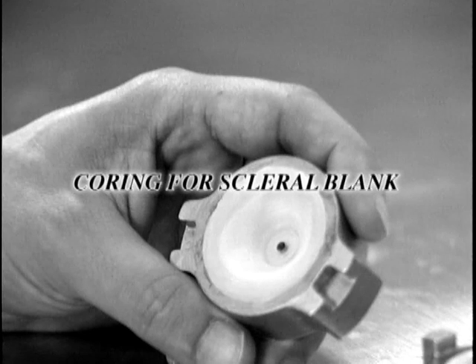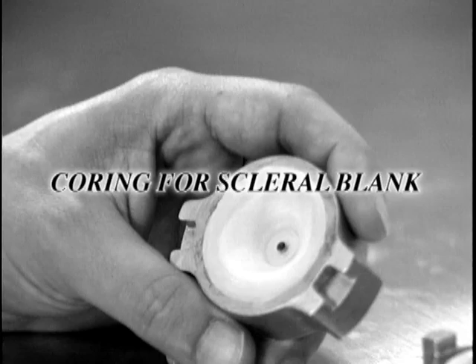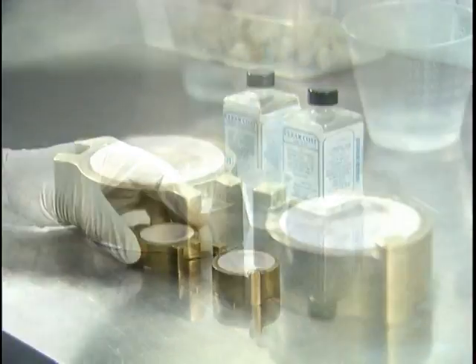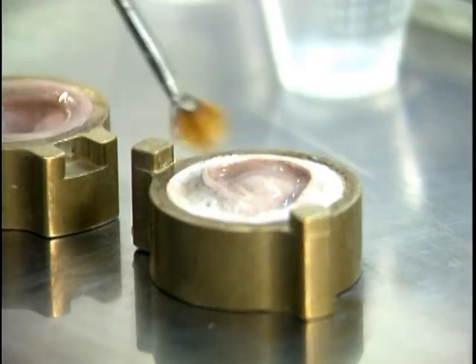The coring process is an important part of silicone eye making because it creates the interior void, thus creating room for the optical silicone. To prevent hydrogen gas bubbles, we seal the surface of the stone by brushing on two coats of model hardener.